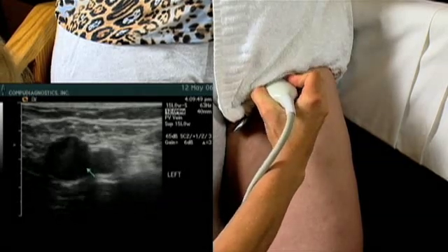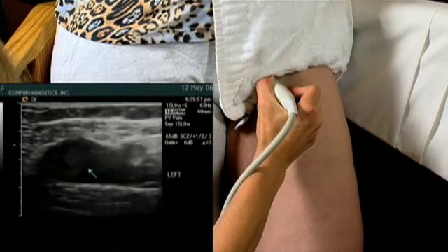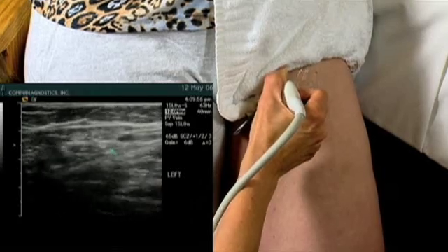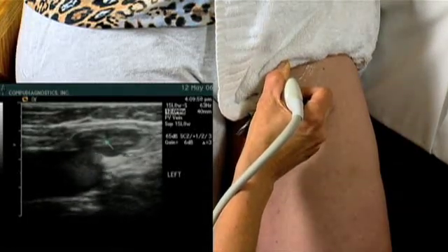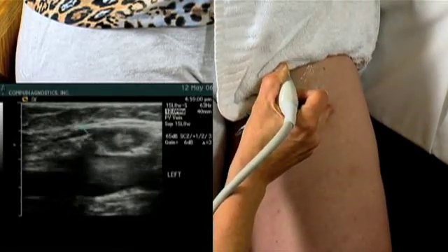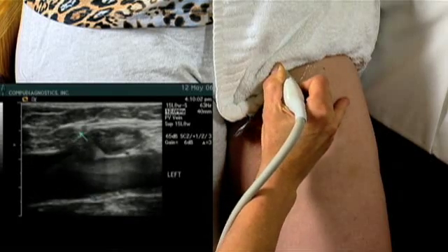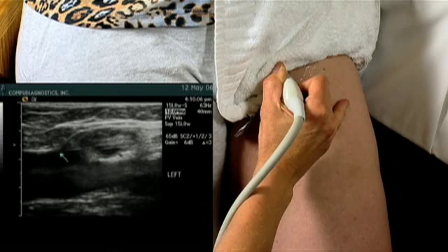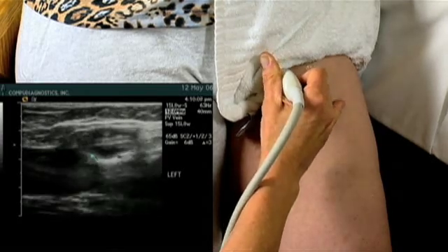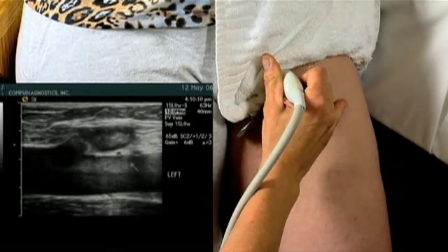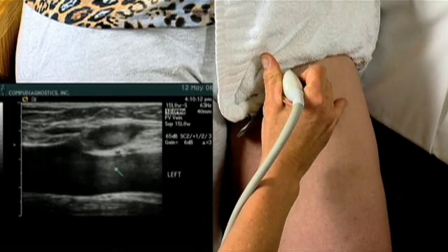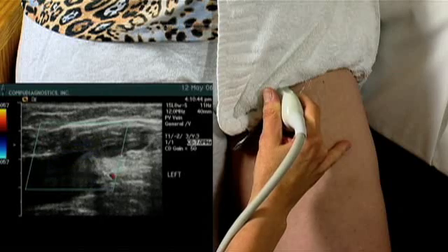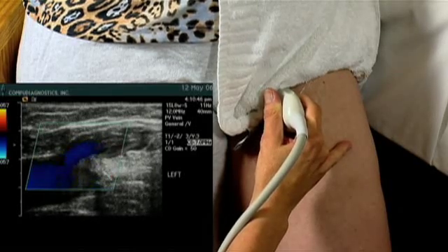We'll now go into a longitudinal view from our grayscale, demonstrating the great saphenous vein, superficial epigastric vein, terminal valve, thickened valve, and the dilated common femoral vein. We see sluggish flow within both veins.